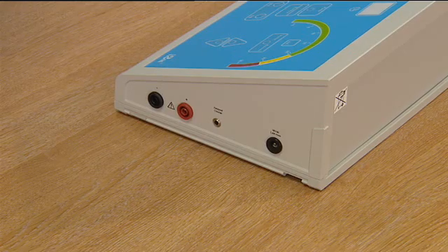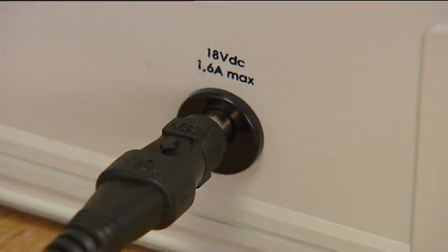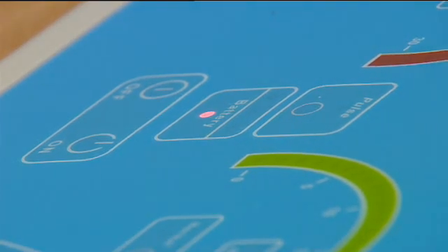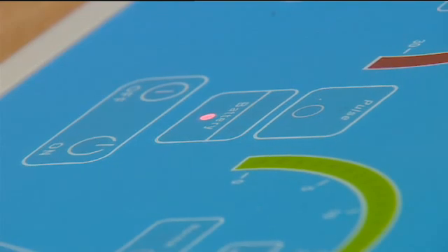To recharge the battery, plug the lead of the power supply into the machine on the right-hand side and then place the plug into the main socket. When switched on, the mains red light will come on. This red light only indicates that the machine is on mains charge and does not indicate that the battery is fully charged.